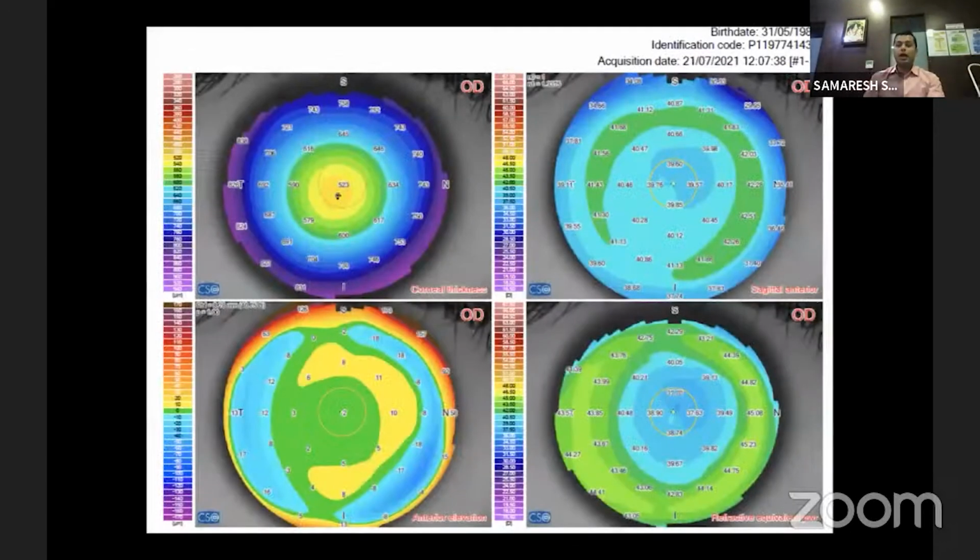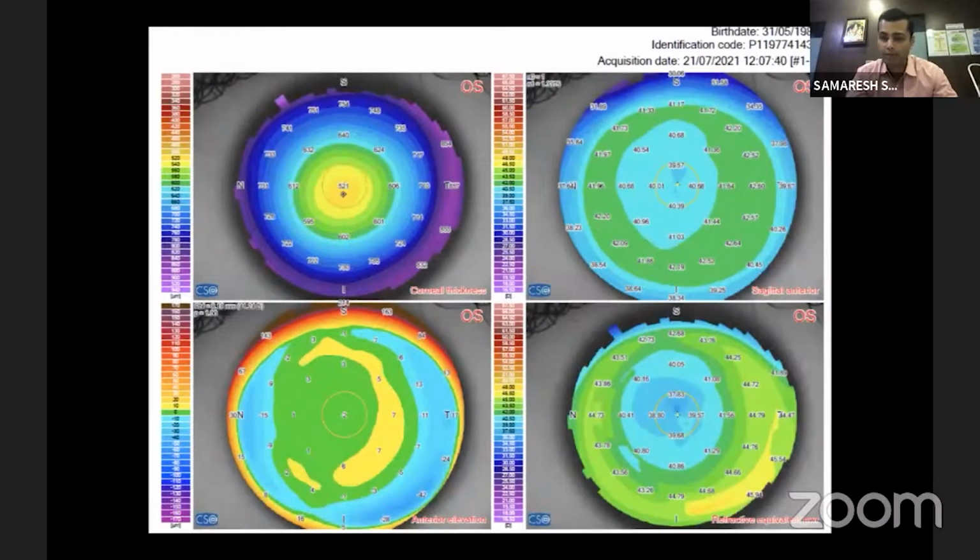Now, this is typically how a LASIK would look if it's done well-centered. This is particularly because it's a topography-guided LASIK. You can make out, if you look at it on the right side, that it's a fairly well-centered ablation zone and really well within the pupillary area. And this is the patient's not photopic, not mesopic, but an ambient light pupil, which is where he would be most of the time. And it's a very well-centered ablation profile. And so it happened with the left eye.